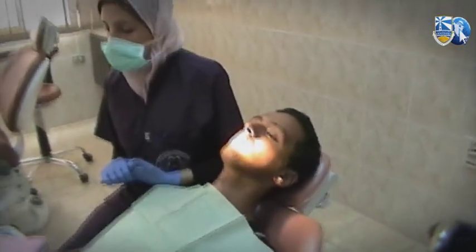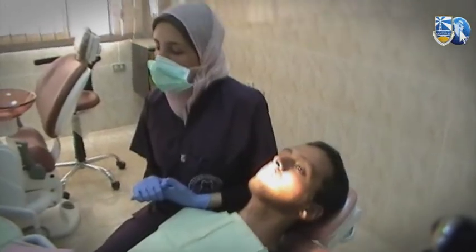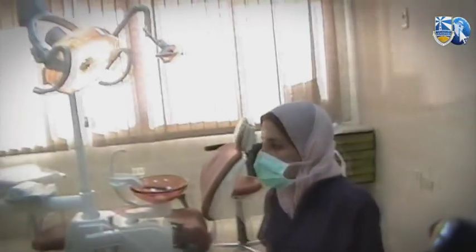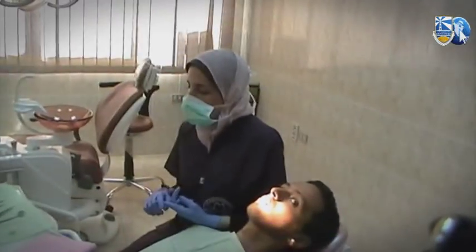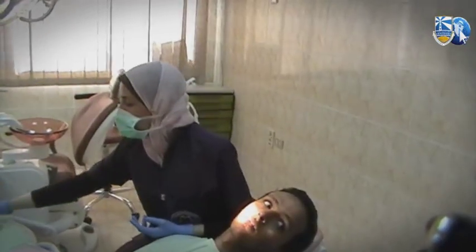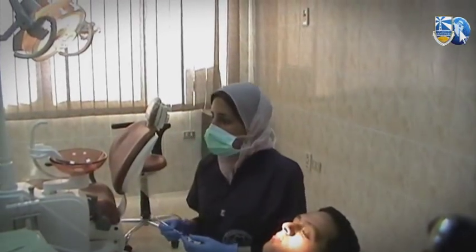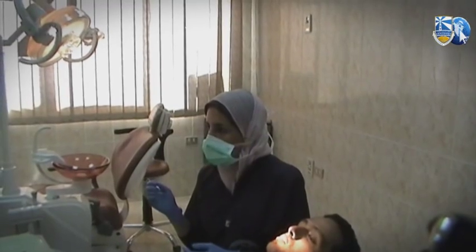The next item is furcation involvement. I can examine furcation involvement by two methods: clinically on the patient and radiographically on X-ray. Here we will see the clinical method, using Nabers' probe to examine furcation involvement.